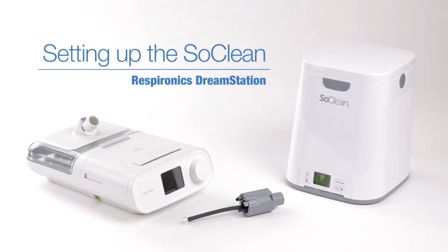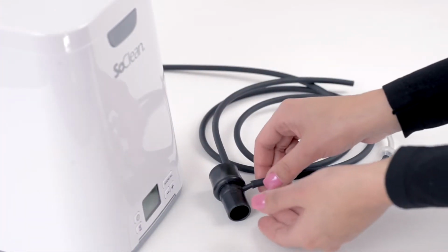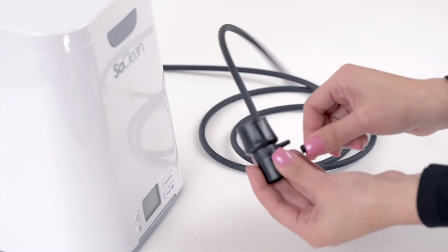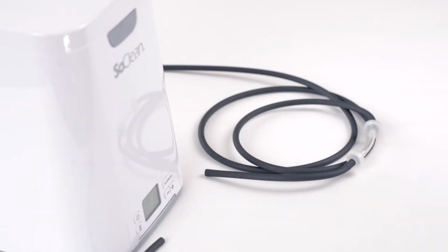You will need the Soclean CPAP adapter and diffuser for Respironics Dreamstation and System 1. Detach the injection fitting and short hose from the main Soclean hose. You will no longer use the injection fitting and short hose. Save these parts in case you need them in future.